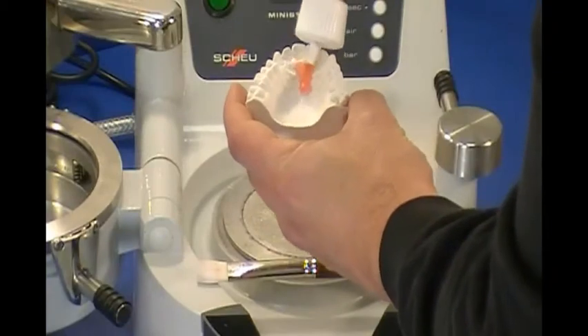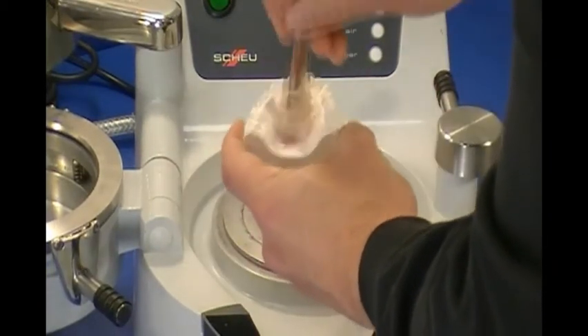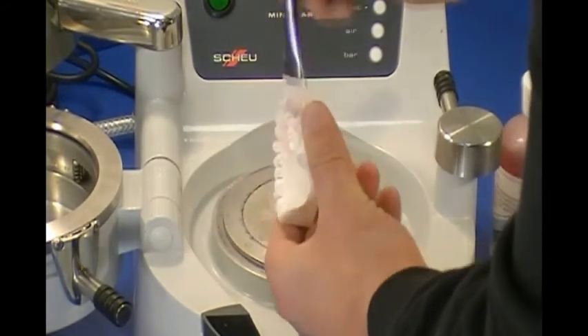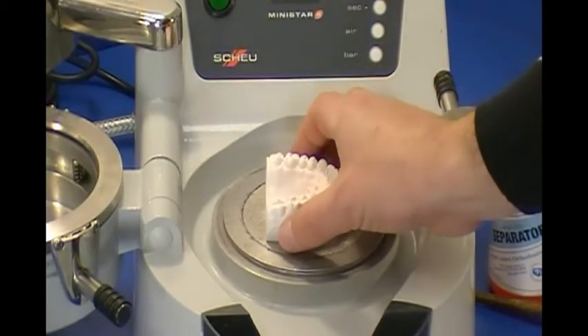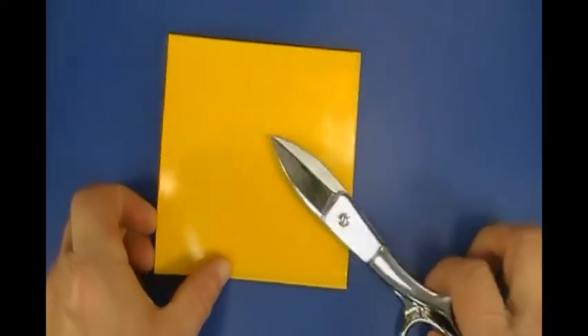Liquid separator is applied with a brush to all model surfaces to come in contact with the forming material. The model is placed on the center of the platform with the heel facing the open chamber on the left. A square, 2mm thick mouth guard material is tailored to make the first layer.